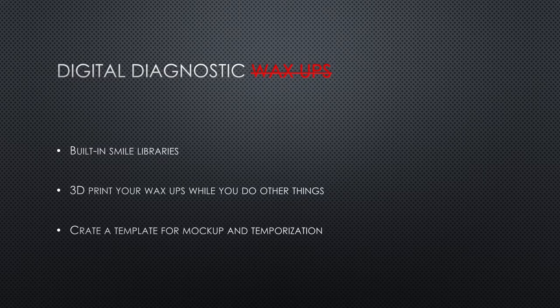So I hate the word wax up. We're not using any wax. I'm a stickler for terminology. So what I like to call them are digital diagnostics or digital mock-ups, whatever you may want to call them. But you're using built-in smile libraries and whatever software you may be using.